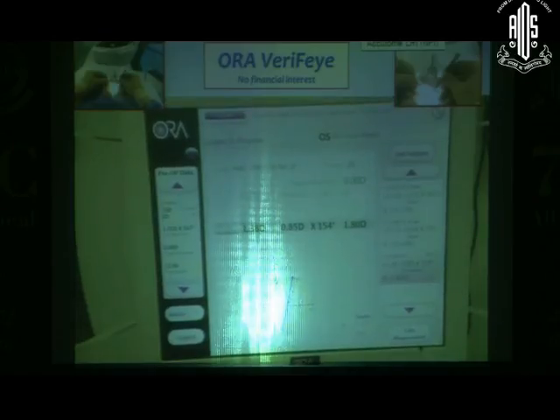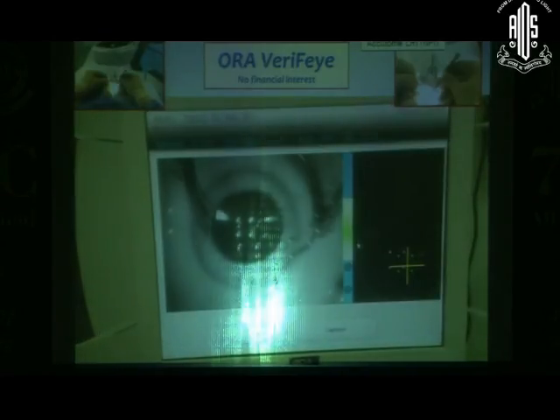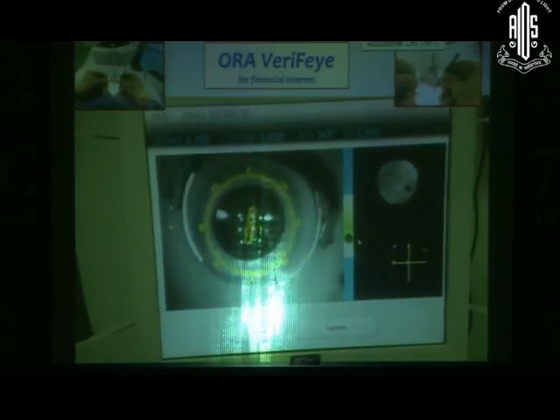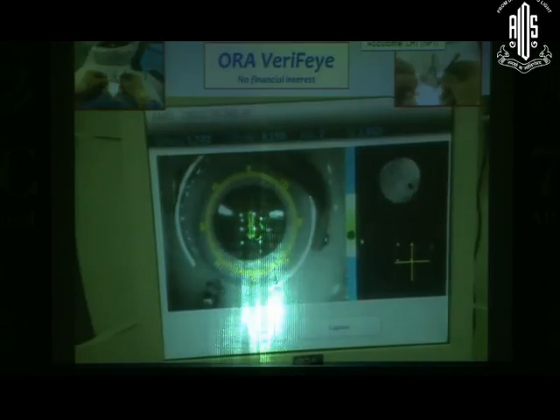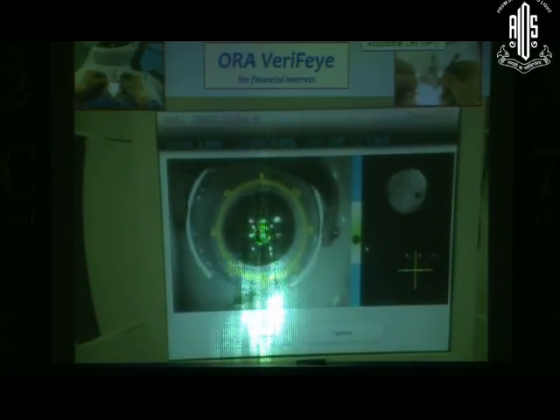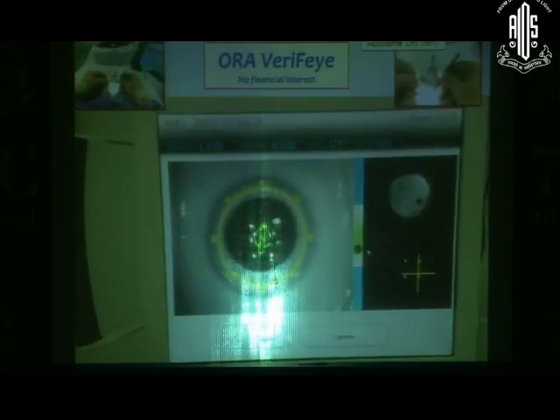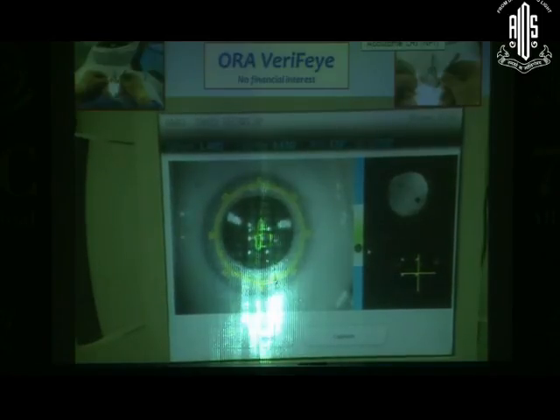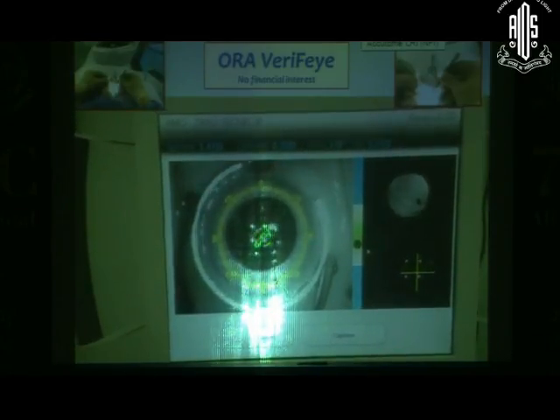1 diopter, axis 154, okay? That's a pseudophakic reading. The lens is in place. So now I'm going to go ahead and make my LRI. So this is a short one I designed. The one problem is the machine takes up some of your working space, so I actually designed a short LRI blade that Accutome sells, but really anyone can do this.